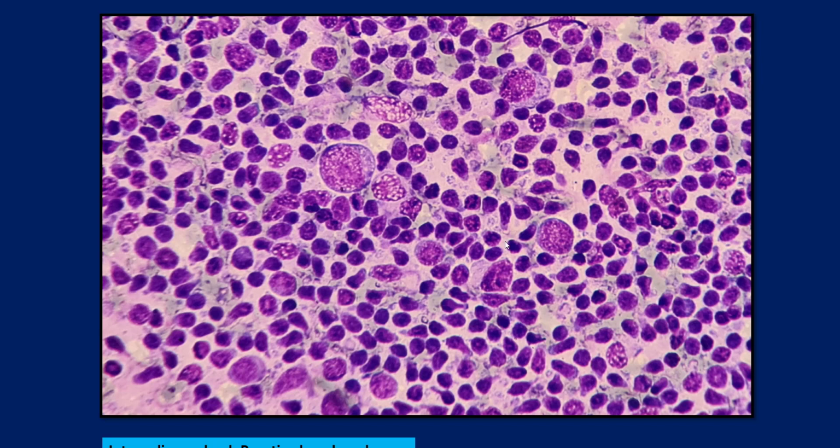This is a picture of an intrasalivary reactive lymph node. You can see a very clear-cut polymorphous population of cells. You can be pretty certain, but you could still have cases of marginal zone lymphomas that look just like this, depending on where your needle has gone. So be very, very careful. If a patient with a salivary gland tumor keeps coming back to you and every time you're calling it a reactive lymph node, you have to be careful. Most likely you're dealing with a marginal zone lymphoma with a very indolent course.